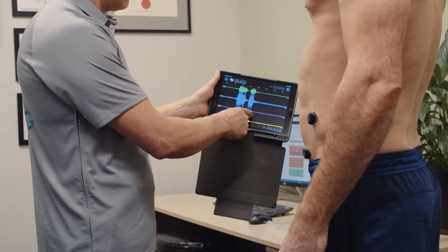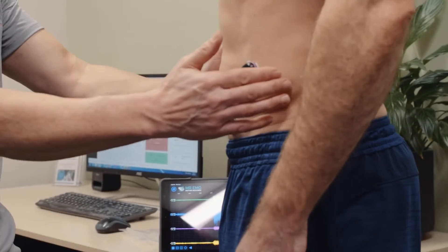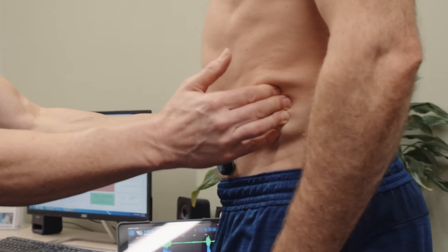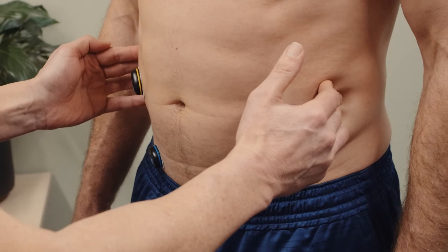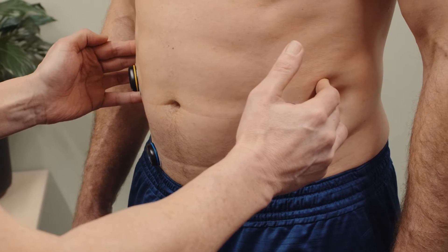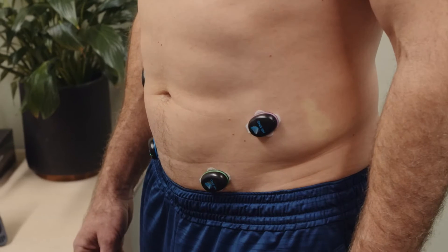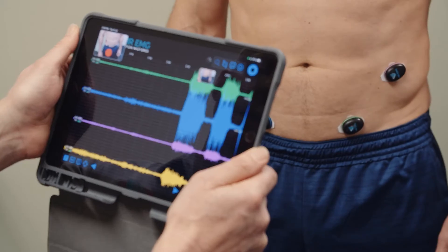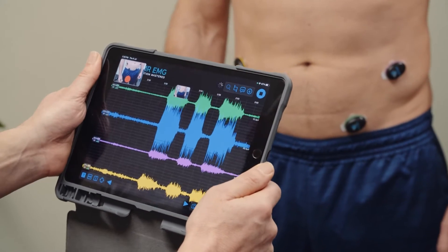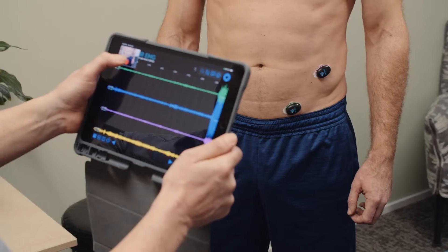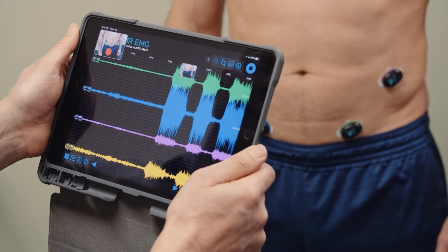Show your subject how to perform an abdominal brace contraction of their obliques by standing functional bracing using Mr. EMG biofeedback. You may need to push your fingers into their waistline and instruct them to push their obliques against your fingertips. Now record your subject performing three maximal voluntary contractions of their obliques. Ensure you take a picture of each activity so you have an image to match your data.